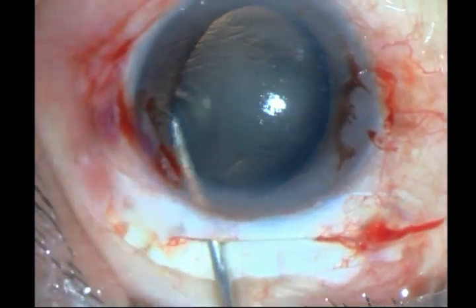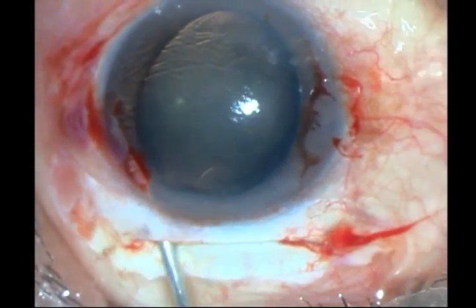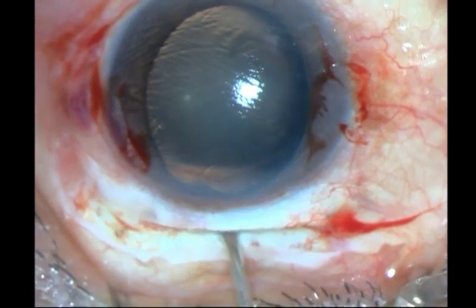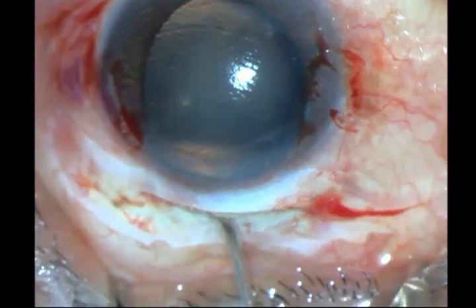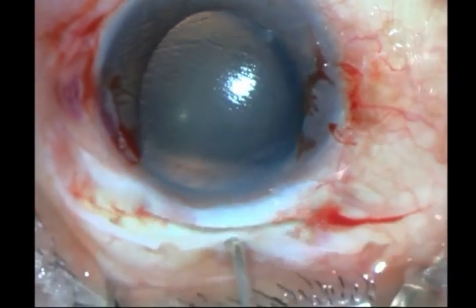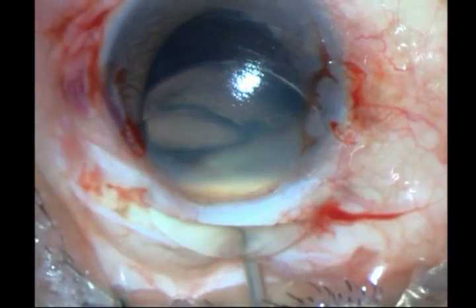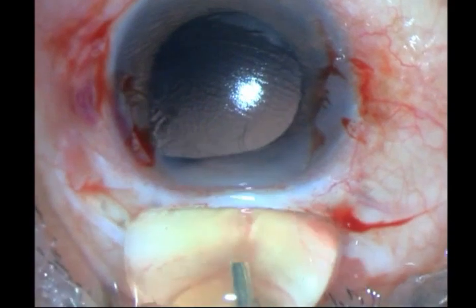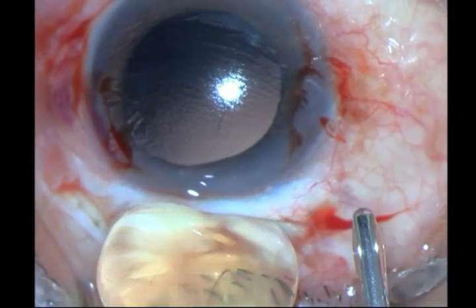Contrary to what people think, if you pressurize the chamber the lens is not going to go straight into the vitreous — it does not happen unless the vitreous is syneretic or you do a vitrectomy. And you can see slowly the whole lens has been delivered with its capsule, clean, without any vitreous.